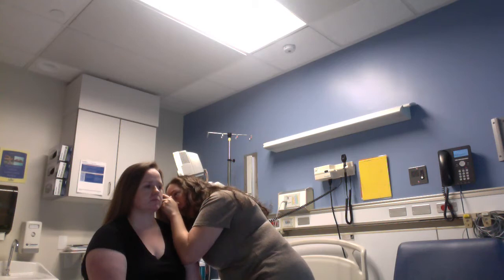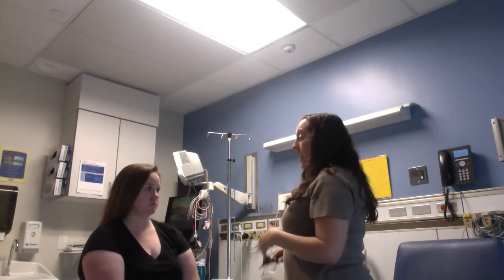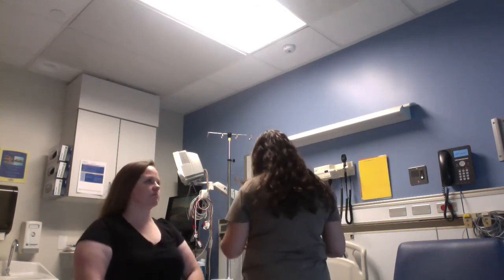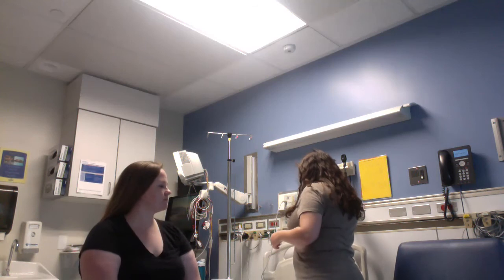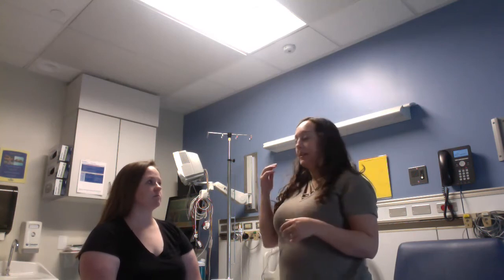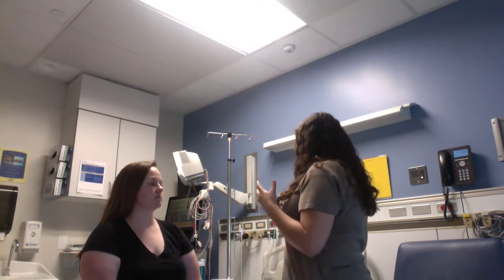Oh, there's a pearly white tympanic membrane, which is supposed to be pearly white. We're wanting to make sure that it's not red, pink, or showing any inflammation. And then we would move on to the next ear and do the same thing with the otoscope. So with that otoscope, we made sure that the tympanic membrane was pearly white. We checked light reflex. It was good.